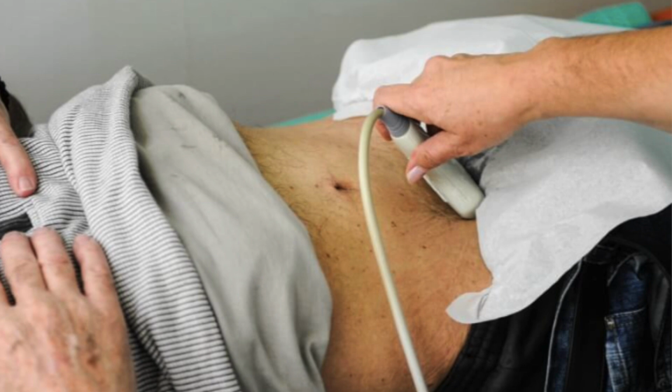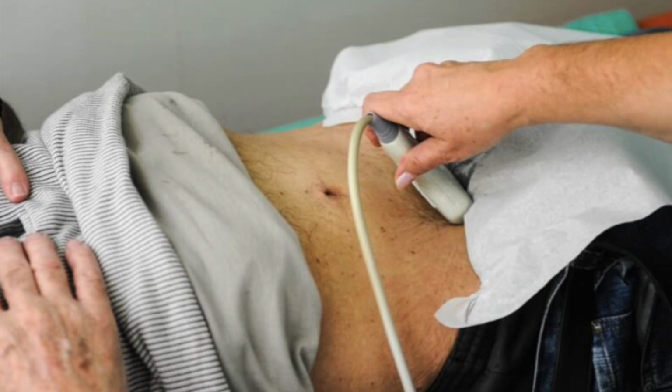The first type of ultrasound is done through the lower part of the abdomen or the pelvic area, that is suprapubic per abdominal ultrasound. This is the first type of ultrasound and that is also commonly done. In this first type, we use the abdominal wall and the urinary bladder and go deep to the prostatic body and check the size, volume and all the details of the prostate.